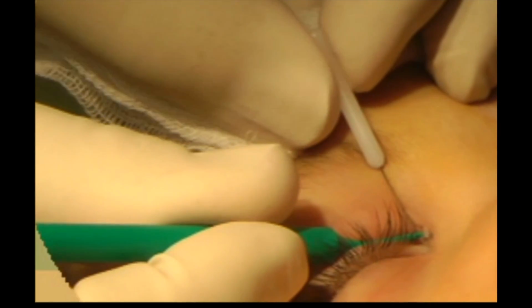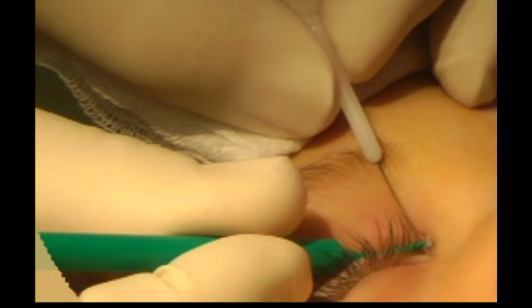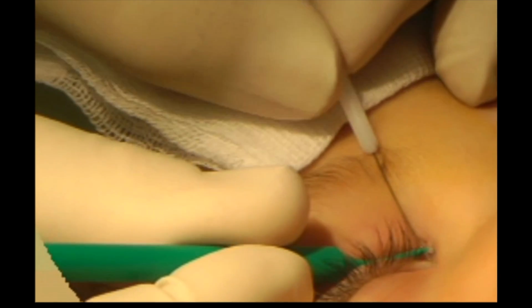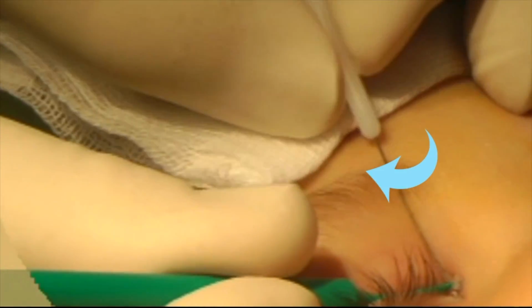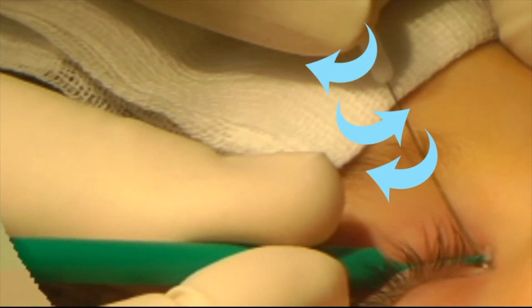Using the dilator end of the green plug inserter, firmly hold the plug in contact with the punctum during removal of the metal introducer. Make sure to pull the introducer out along the main axis of the lacrimal duct. Remove the introducer by twisting it back and forth, similar to winding a watch. Seat the plug in the punctum using the metal tip of the green punctum plug inserter.